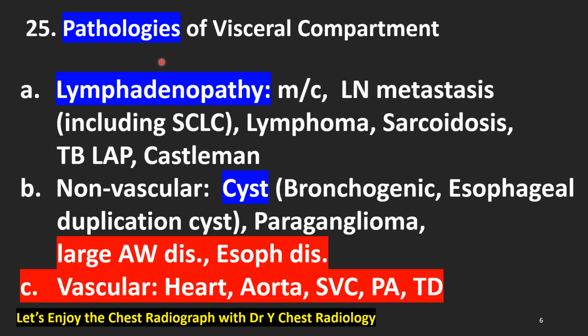Let's preview the pathologies of the visceral compartment. A. Lymphadenopathy. This is the most common disease, such as lymph node metastasis, including small cell lung cancer, lymphoma, sarcoidosis, tuberculosis lymphadenopathy, Castleman's disease. B. Non-vascular lesions, such as cysts, like bronchogenic cyst, esophageal duplication cyst, and paraganglioma.